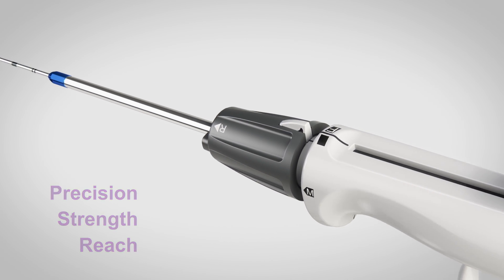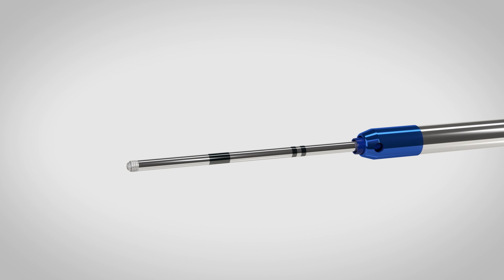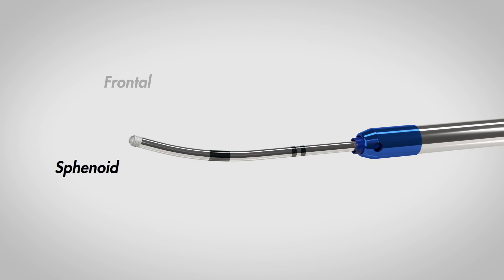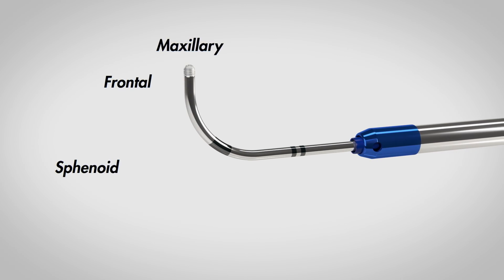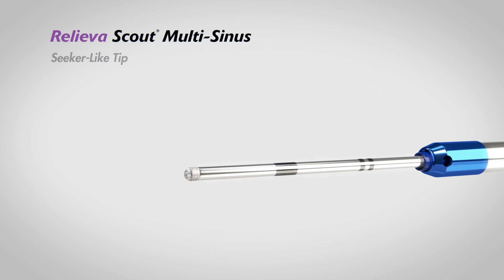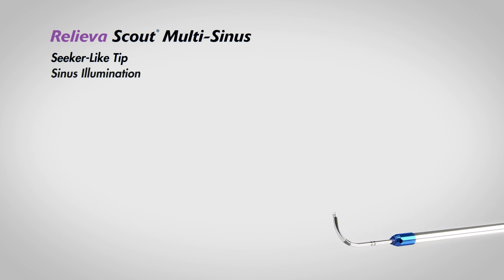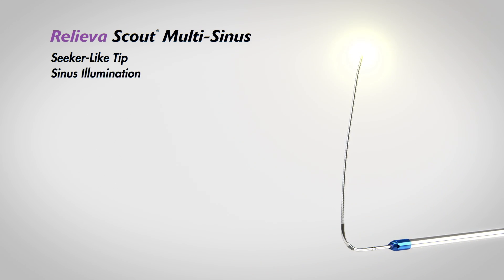The Relieva Scout Multi-Sinus features a shapeable seeker-like tip to simplify access to the sphenoid, frontal, and maxillary sinuses. It unites a low-profile, seeker-like tip to access tight anatomy and palpate tissue, an extendable illuminated ball tip for atraumatic sinus access and pinpoint transcutaneous conformation, and a long 6x24mm balloon to dilate ostium and outflow tracts.